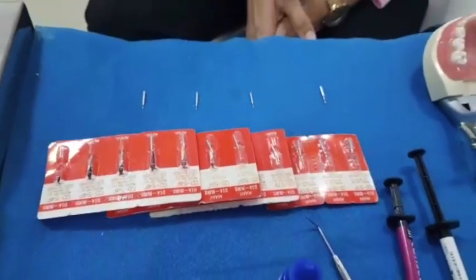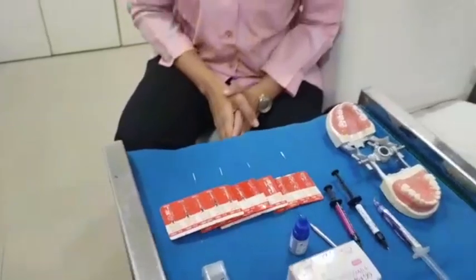All these burrs are a part of the fissurotomy procedure. So what is the fissurotomy procedure? Before we attempt sealing the pits and the fissures, we will be doing something called a fissurotomy — we will just abrade the pits, grooves, and fissures with these fissurotomy burrs so that the acceptance of the sealant is very good, because you have a roughened surface area to accept the sealant.